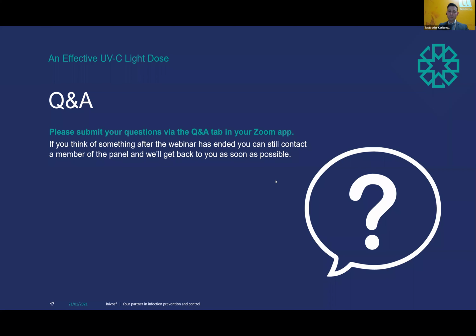So what we're hoping to do in the coming months is determine an effective UVC dose from whichever UVC light source we pick, and then halve that, expose the organism to it, and see whether the bacteria, or whatever organism, would develop resistance. Because if that's the case, we would definitely have to call for better UVC understanding. How do we go about this, so we don't see years ahead of UVC not being the right tool?